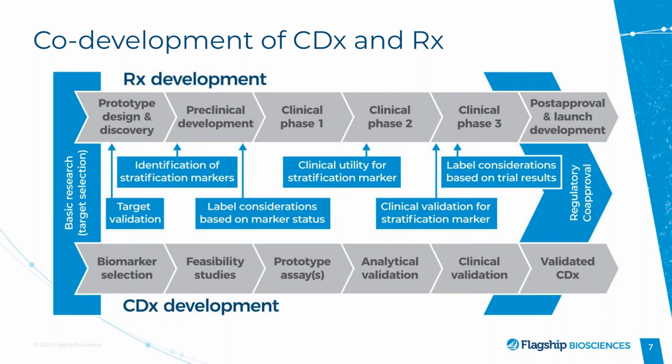And I do want to point out, this is something you just can't do overnight. Developing an assay, getting it to a laboratory developed test level does take some time. And another thing to keep in mind, going back to really paralleling your drug development, this is important. You also want to start this early because, in our situation, this assay needed to be up and running for us to actually enroll patients. And, especially for a smaller company, it was very important for us to have it running so it didn't delay the clinical development program. So, we got the assay up and running, and now we are currently prospectively screening patients for a phase 2 trial that we are running right now.